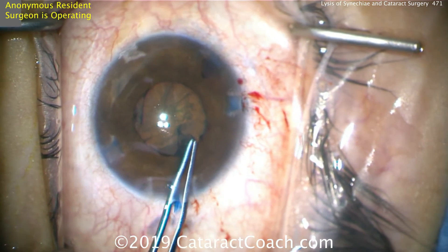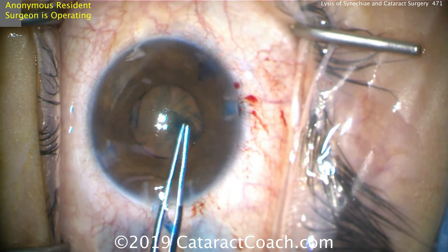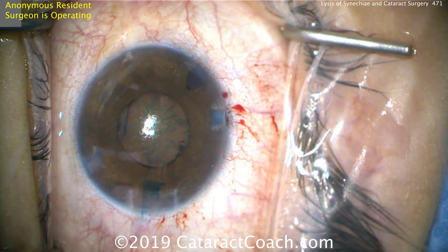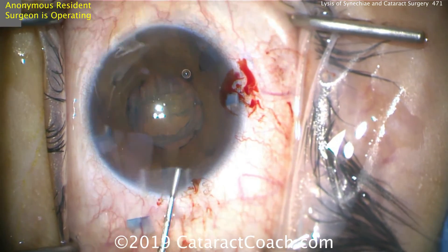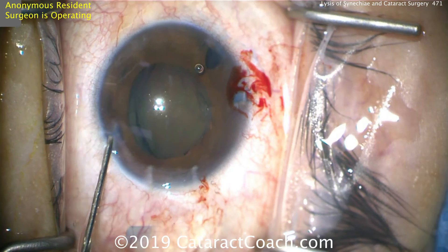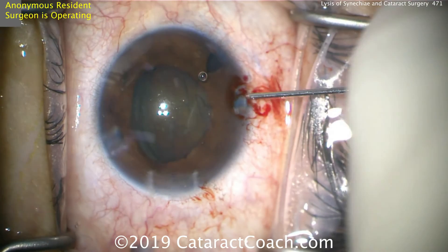You definitely want a generous capsulorrhexis in these eyes. The iris will adhere to the anterior lens capsule and form synechiae, but the iris won't adhere as well to the surface of the acrylic IOL. So if we have a nice 5 or 5.5 mm capsulorrhexis, we'll be able to prevent synechiae from making the pupil smaller than that. Here's hydrodissection — this is a relatively young patient. Let's get this lens nucleus out of the capsulorrhexis, because we're not sure if that pupil is going to come down again.